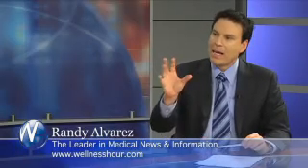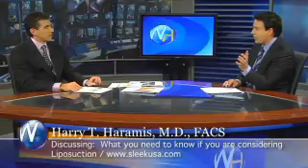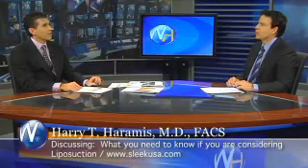Now the back fat, is that a tricky area? Is it tougher for you, more technically demanding, or is it just like any other part of the body? No, it's a tricky area because the skin's very thick back there, and the fat tends to be very fibrous and thick, and that's where this smooth sculpt technique is so great, because it really breaks up that thick tissue. Regular liposuction has a very hard time getting out that tissue.